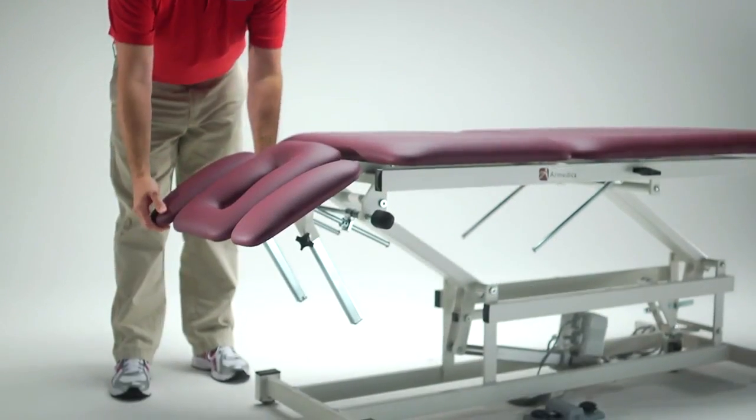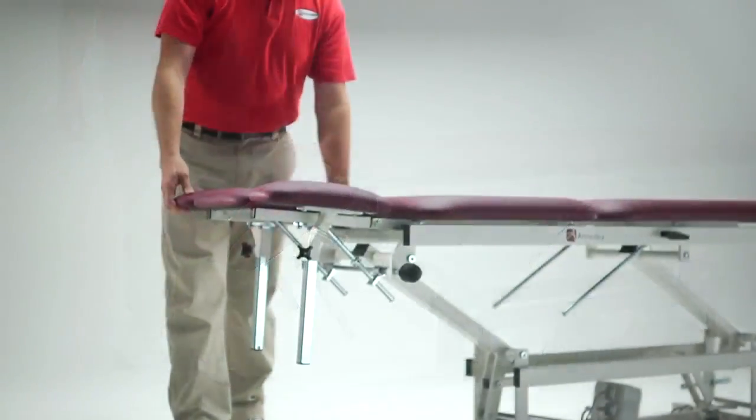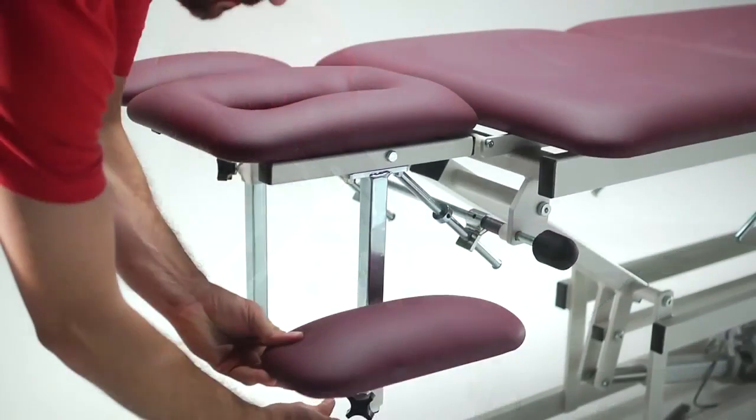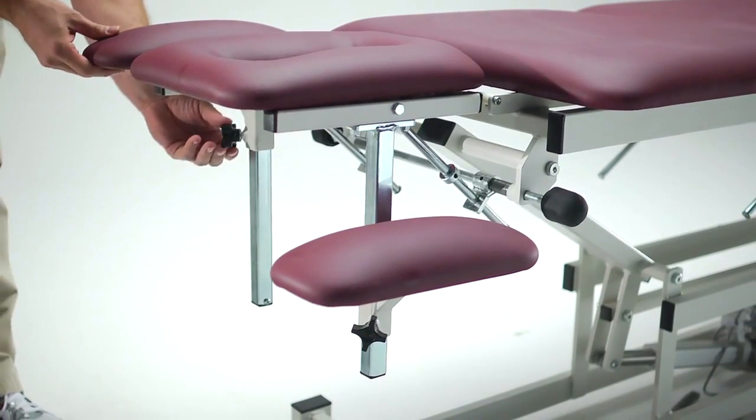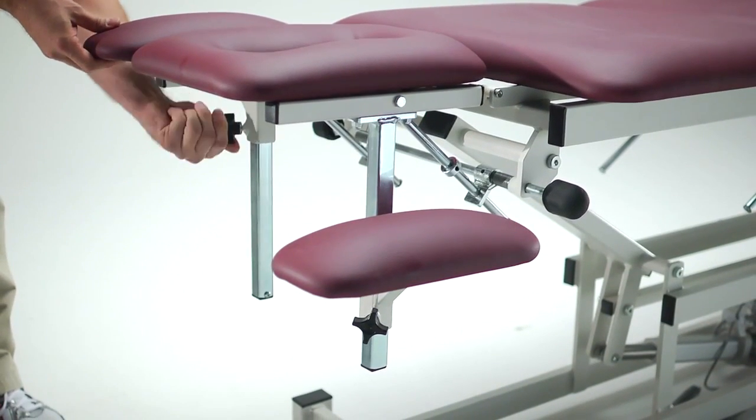The head section lowers to 90 degrees and raises to 45 degrees, with 6-inch drop-down armrests that remain on a plane with the headrest, allowing greater range of arm positioning when the patient is being treated.